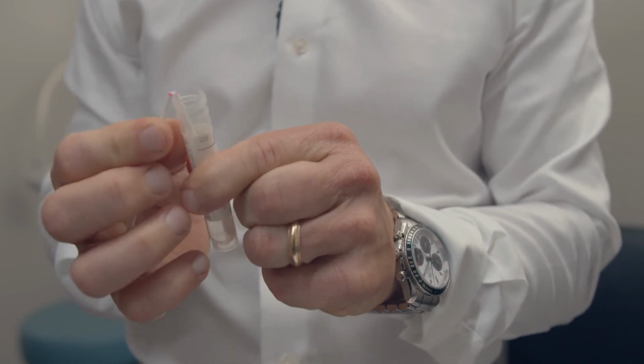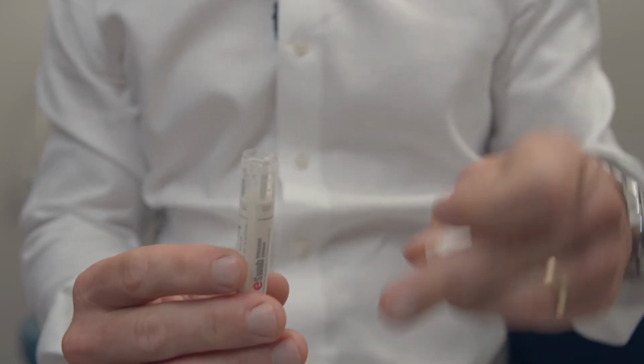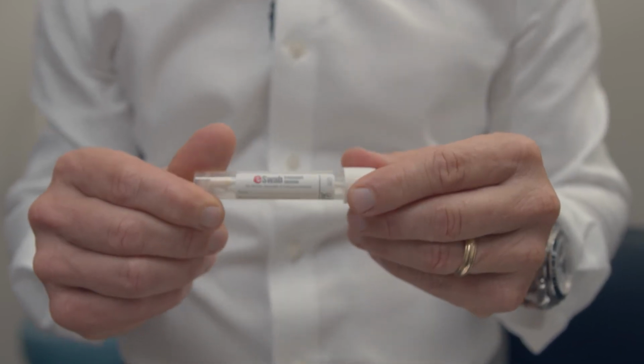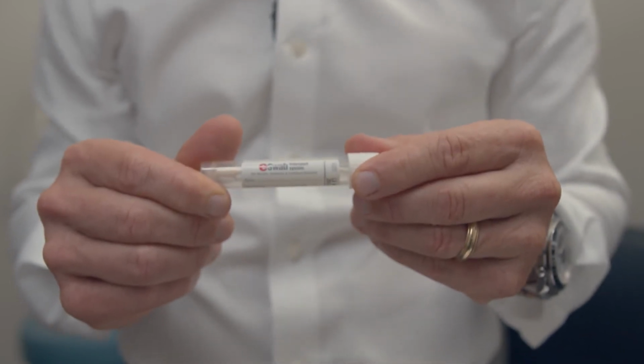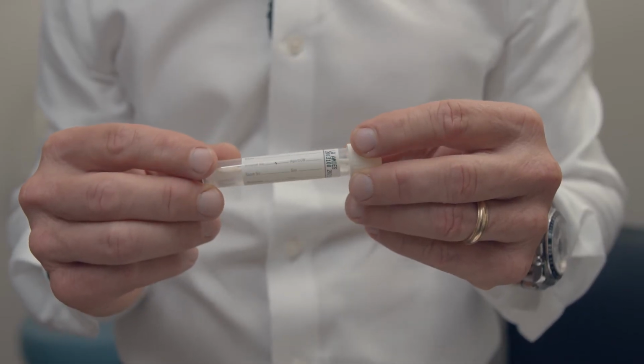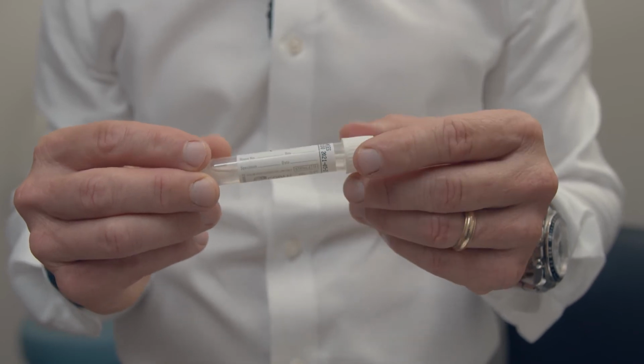insert the swab in first. Your red line lines up. You break it off, discard that, tighten it down. Simple as that. You've done your collection. You're going to notice there's some lines on here. Once again, the important parts: name, date of birth. Nothing else needs to be filled out. You can fill out the date of collection if you wish, but it's not mandatory.